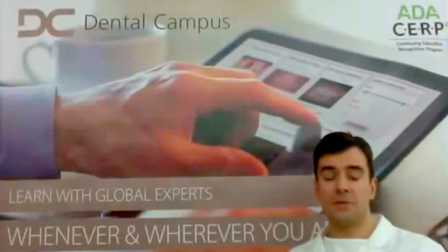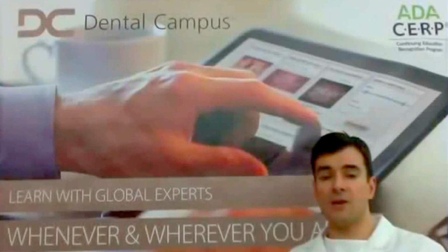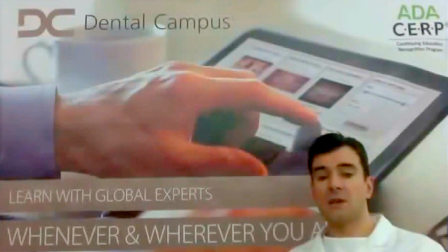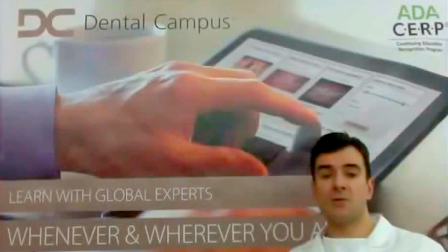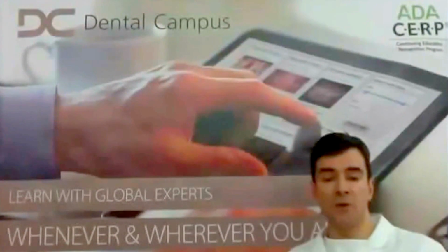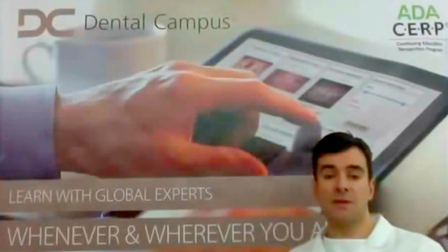This is typically done for a missing lateral incisor. In the posterior segment, I'm open to both, but for prosthetic reasons, to reduce the possible technical complications, I prefer to place 2 implants and restore them with 2 crowns.